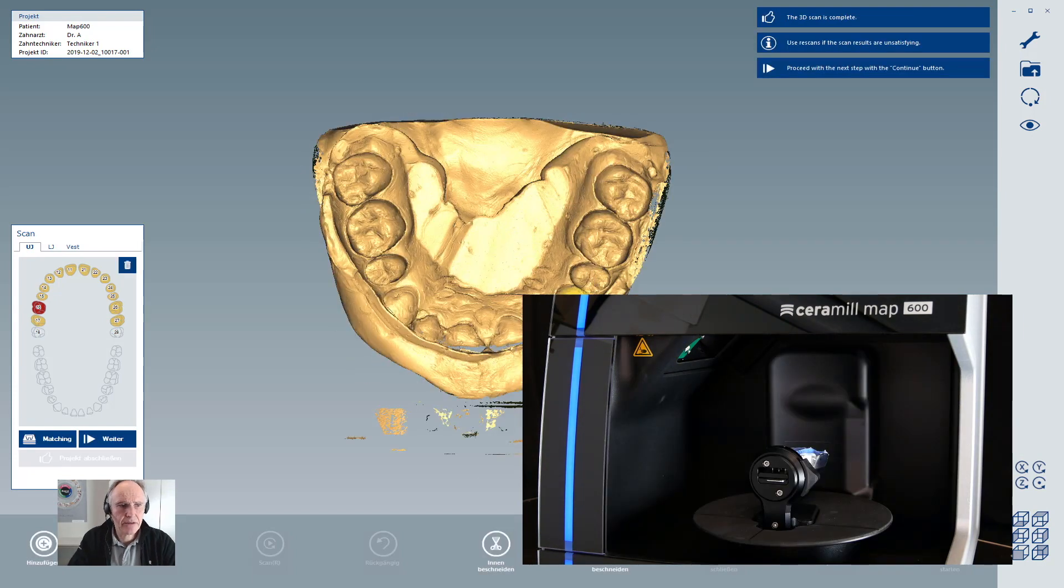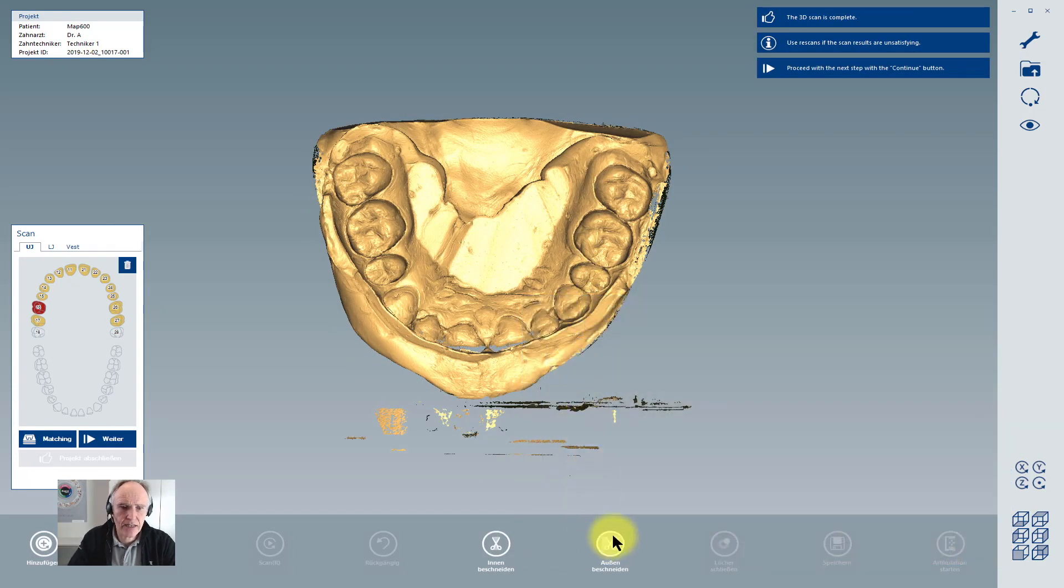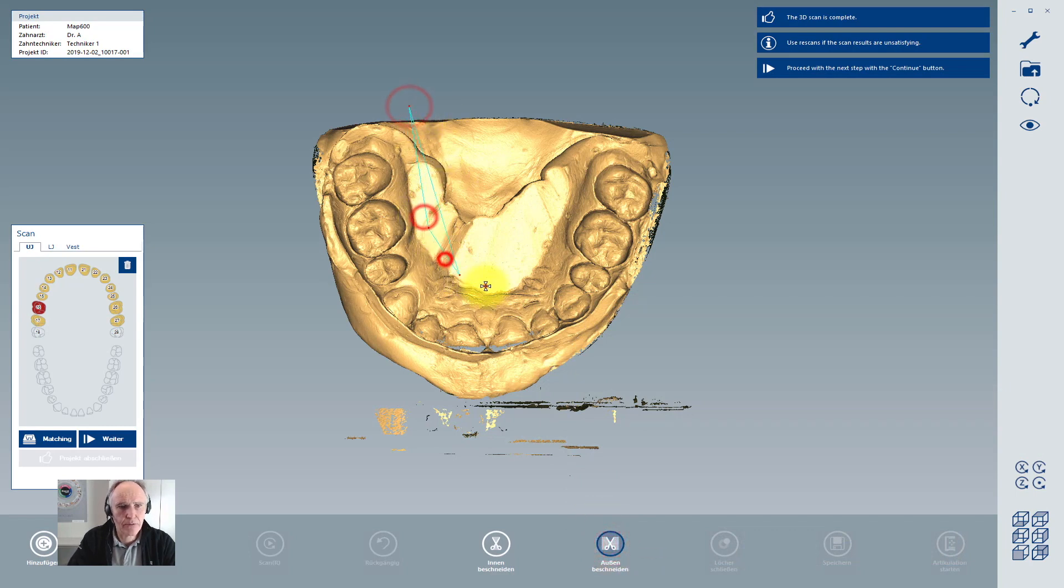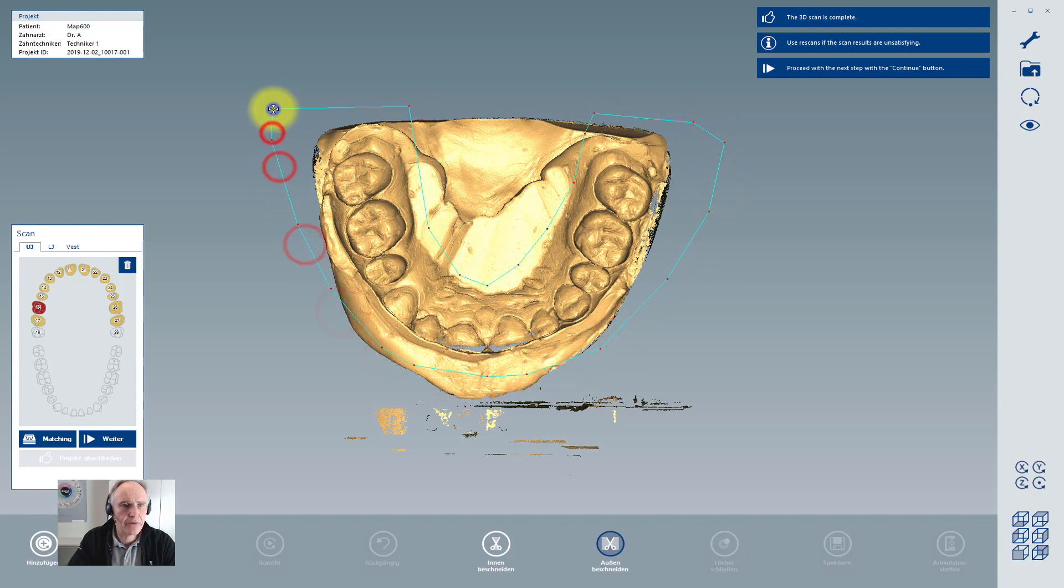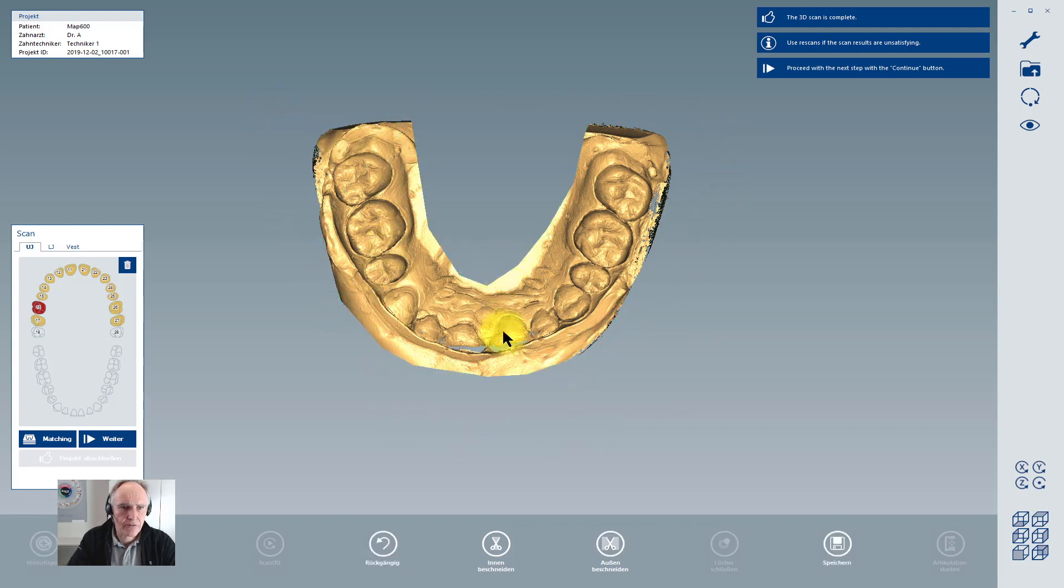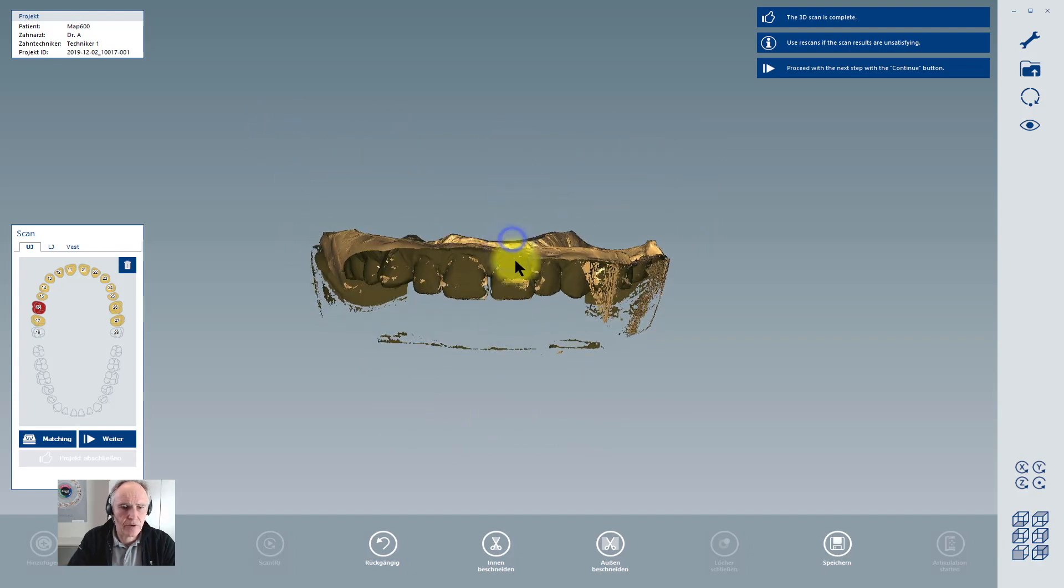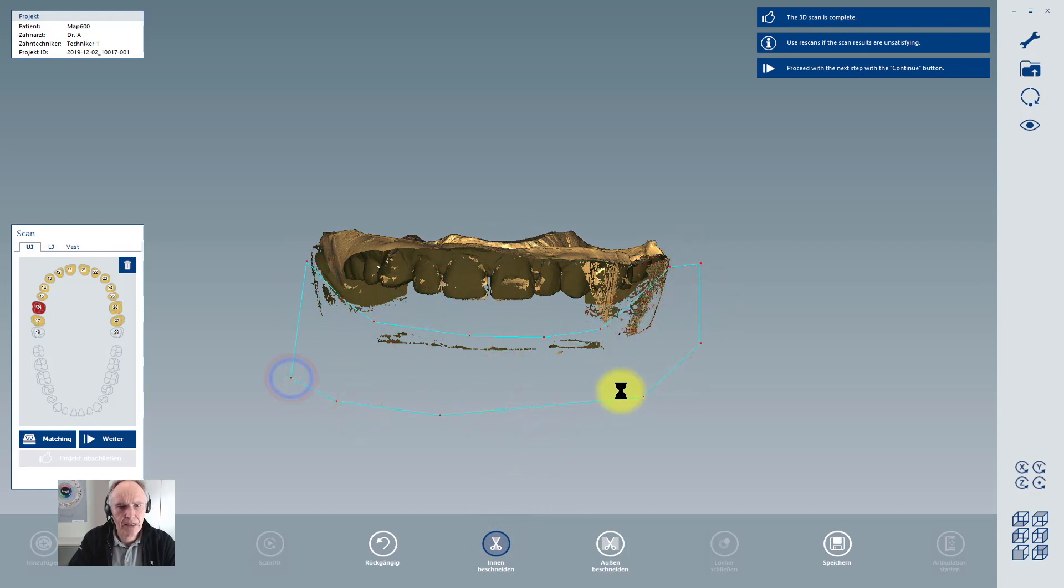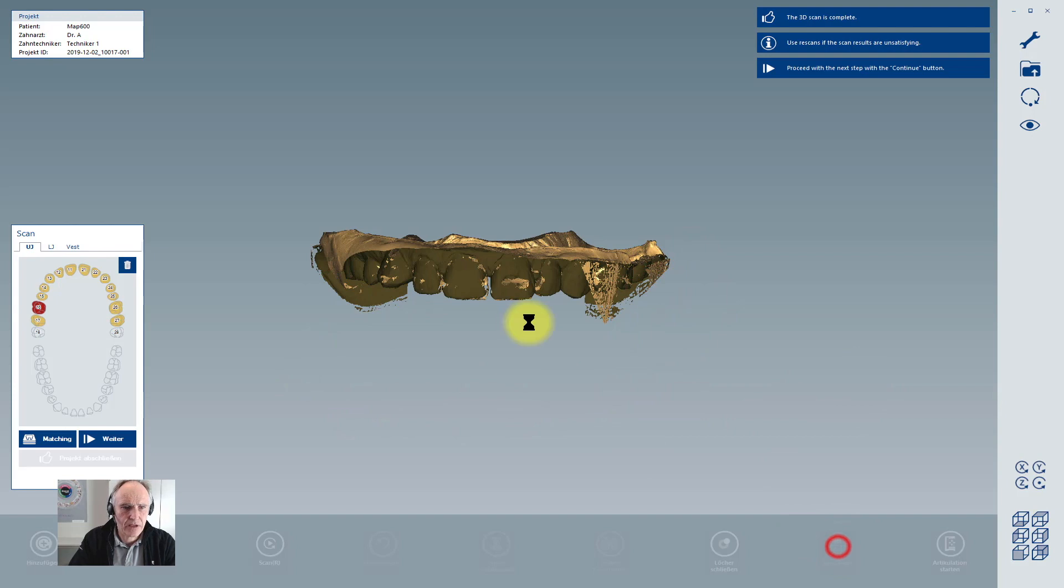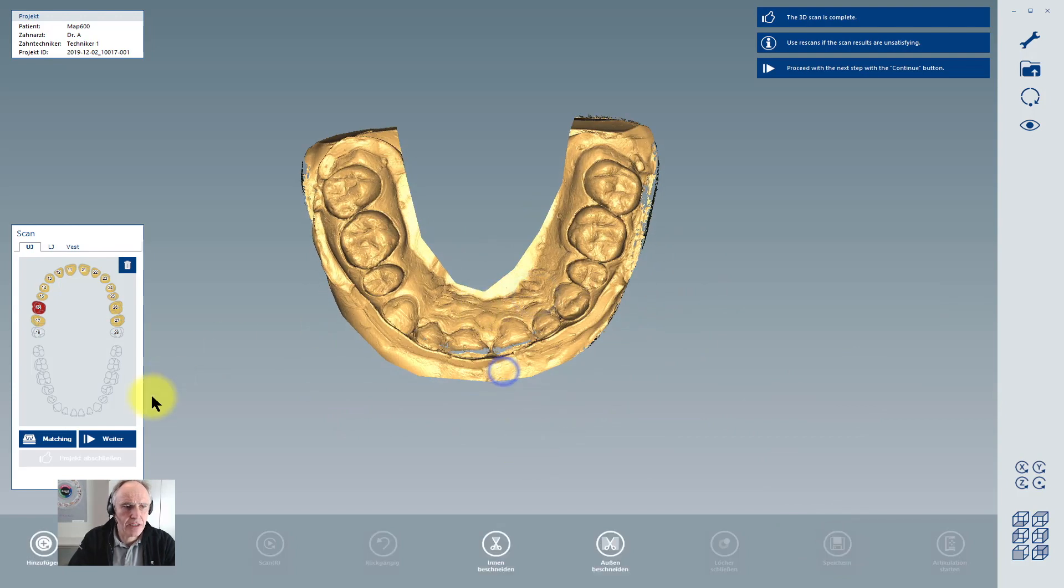After having scanned the upper jaw, you can select here your tools for cutting away material you don't want to have. The first is I look from the top and the second view I look from side. I take the other cutting tool to take away material I don't want to have. After that I click on save to reduce the data to the minimum.